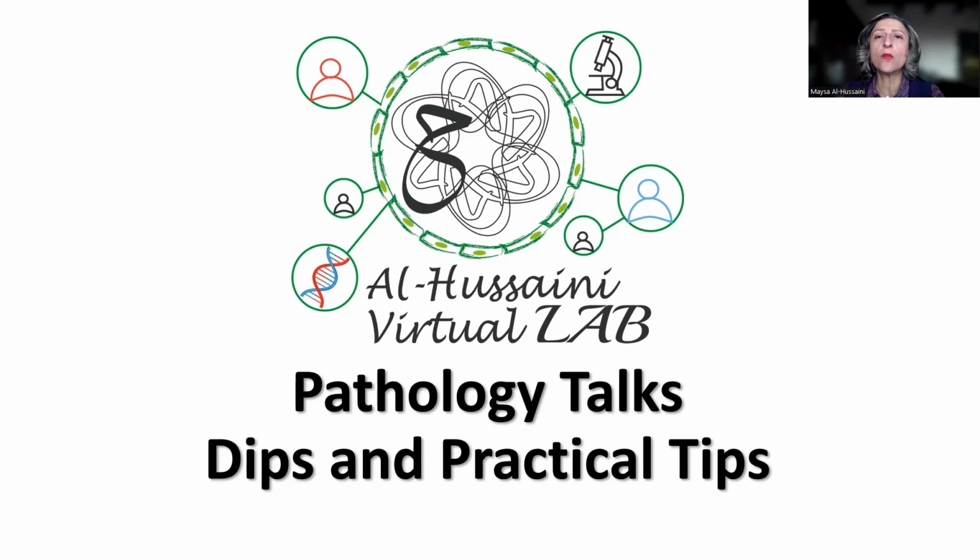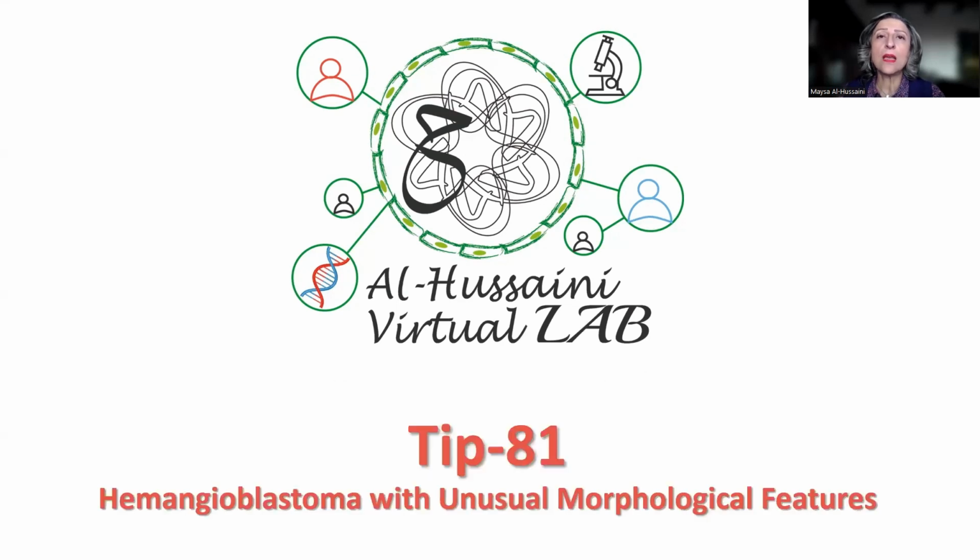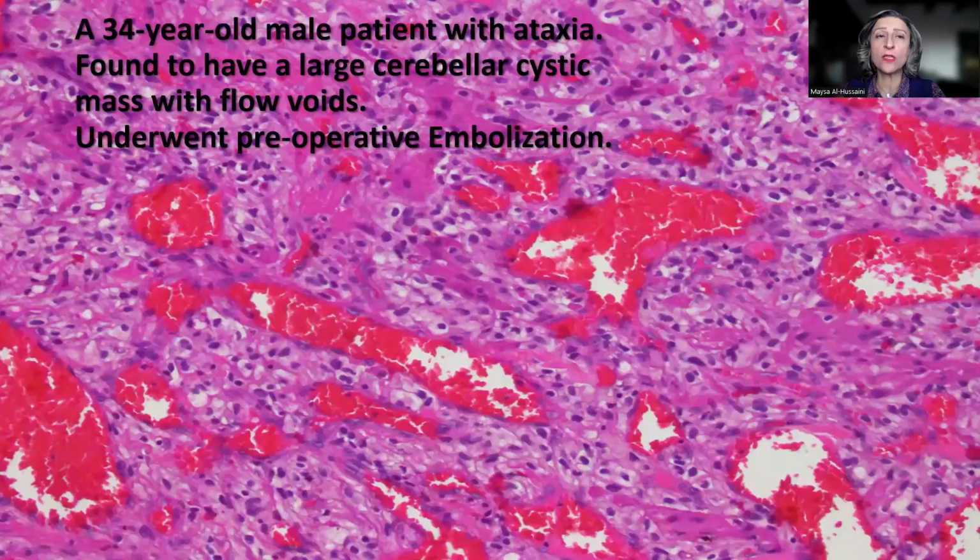What I'm going to be sharing with you today is a nice case of hemangioblastoma showing some unusual morphologic features. So this is a case of a 34-year-old male patient who presented with ataxia and on imaging was found to have a large posterior fossa solid and cystic mass with flow voids. And this is an excellent clue to the diagnosis of hemangioblastoma on radiology. So he underwent preoperative embolization in order to minimize the vascularity of the tumor.